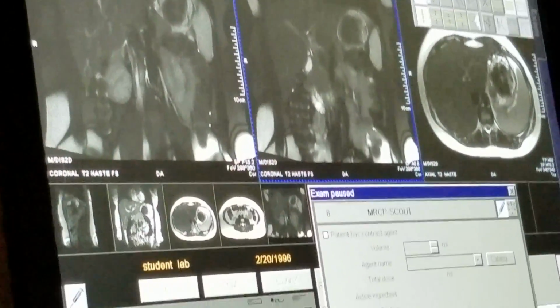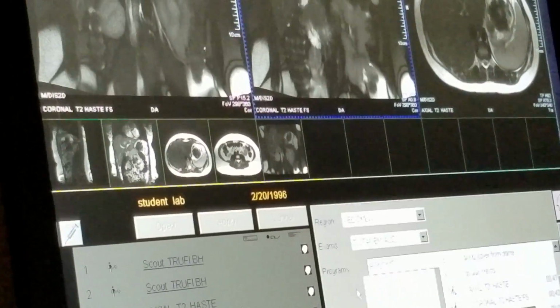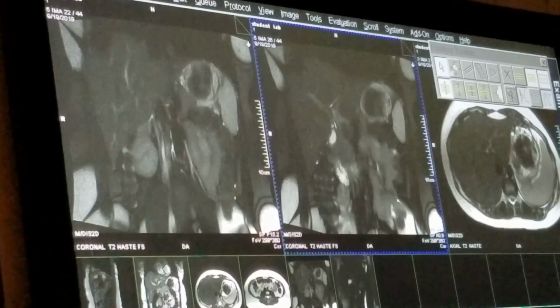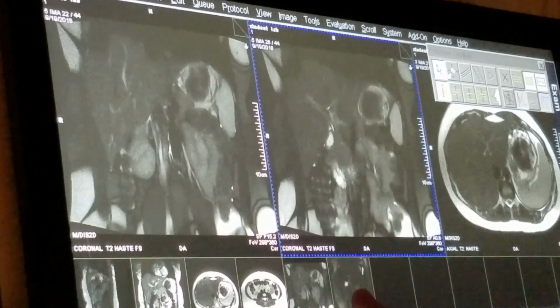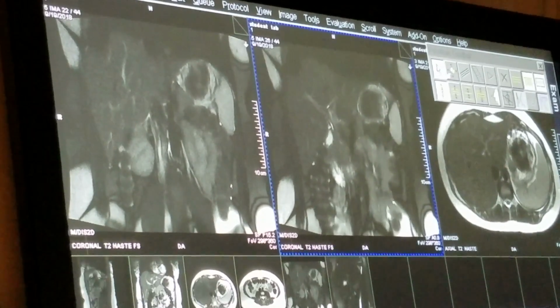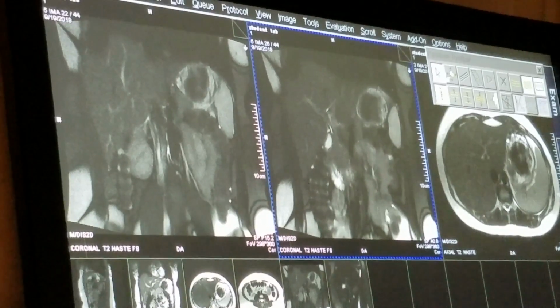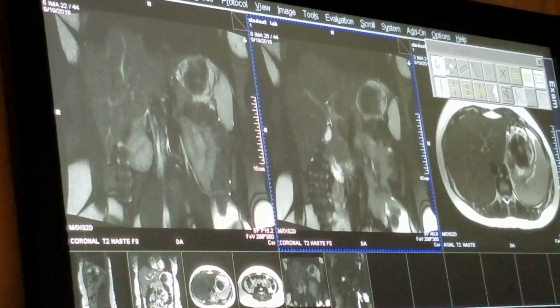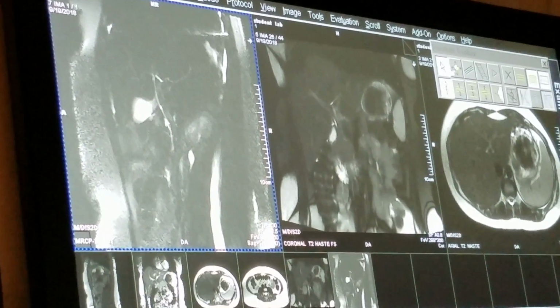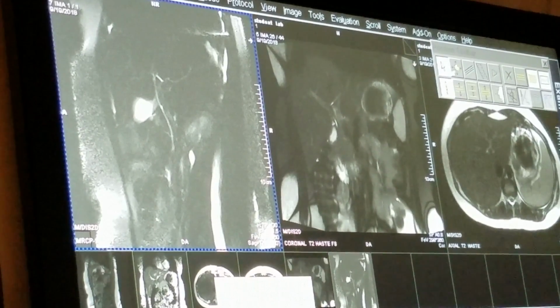All right, so right now, please take in a breath and hold it. And I don't tell them to breathe until I either see an image populated or this counts down to 0. Because just because you stop hearing the noise doesn't mean it's still not receiving the data. These are just one quick single shot scans. So I'll leave this image here, and I'm going to bring this image up here. Now you can see this nice thin common bile duct in the sagittal plane.